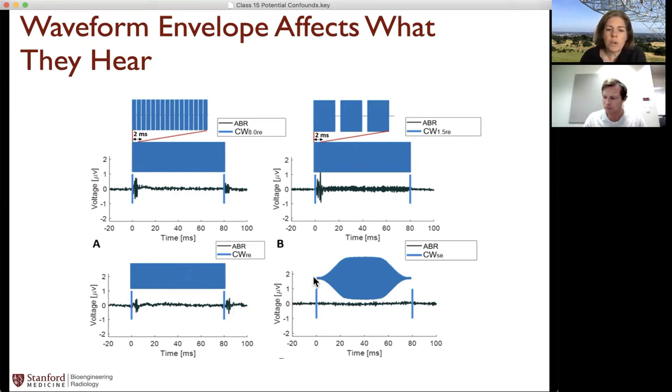We also did an experiment where we intermixed here the continuous wave, but we smoothed out the waveform. So you can see how smooth it is on the on and the off. And what we found was that there wasn't an ABR signal from that waveform. Again, these experiments now are done in the wild type hearing mice. So that just shows that the waveform affects what they hear, and it gives us a method forward for how to design these experiments so that the animals don't hear anything. We just have to design the experiments with a waveform that's smoothed enough so that it doesn't trigger an ABR response or a hearing response.